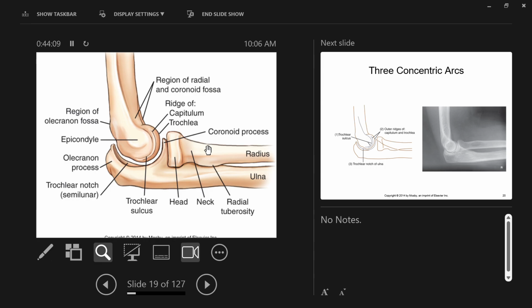You don't see a break in the bone like you see with grown-up skeletons, right? You will see just everything shifted backward, and they draw this anterior humeral line, and all of a sudden everything is behind that. All of this gets rotated or shifted or bent backward, if you like. And that's what we call a supracondylar fracture. Supra means above the condyle, so the fracture's happening up here or higher.